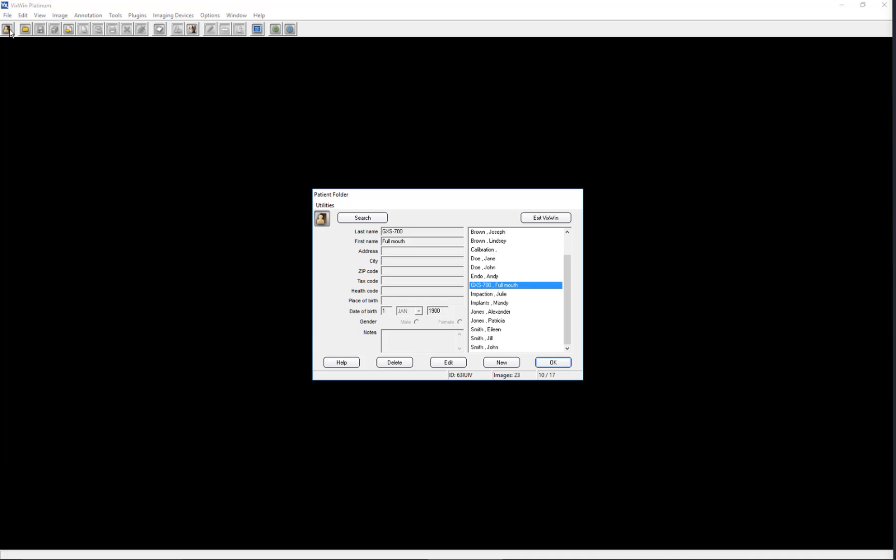In Standalone Mode, you will double-click on the VixWin Desktop shortcut to open the software. When the software opens, you will be in the Patient folder. To start a VixWin session, you must create a new patient or select an existing patient before acquiring images.